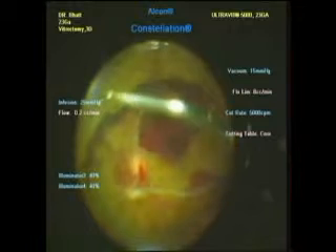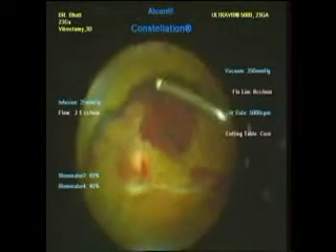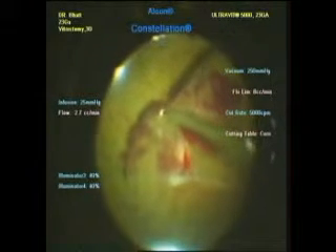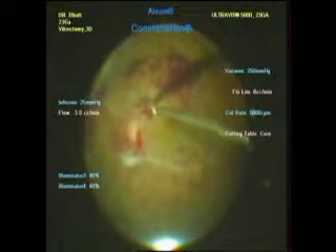We can see there is an advanced PDR with subhyaloid hemorrhage and a very thick posterior hyaloid. Here we are using the cutter to dissect the posterior hyaloid and to get access to the subhyaloid space where we can remove the subhyaloid blood. A very thick posterior hyaloid attached to the posterior pole is dissected carefully.